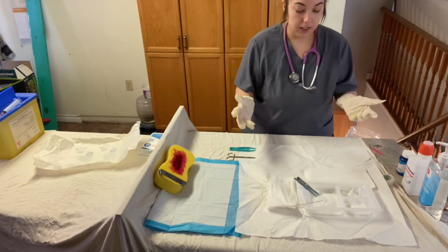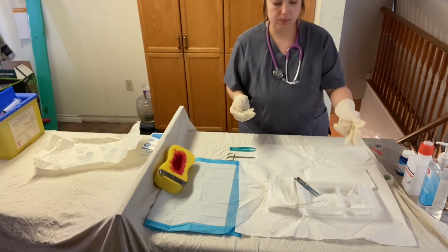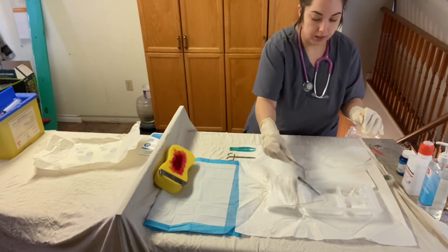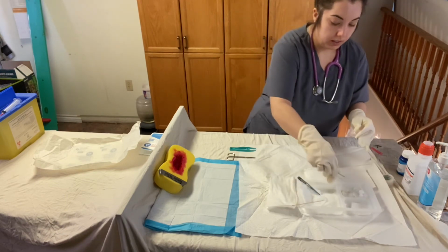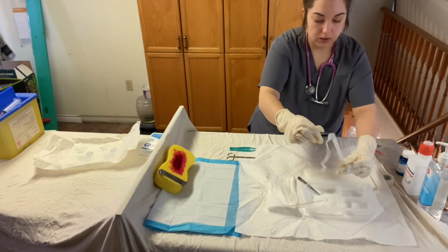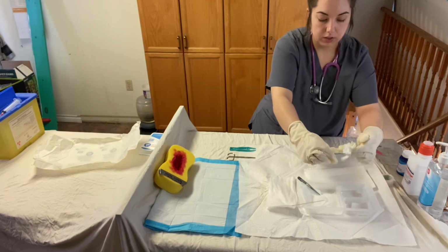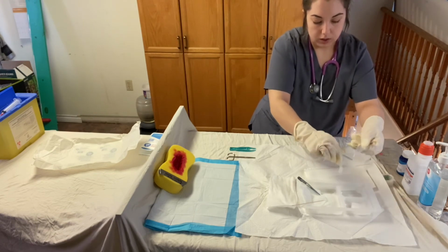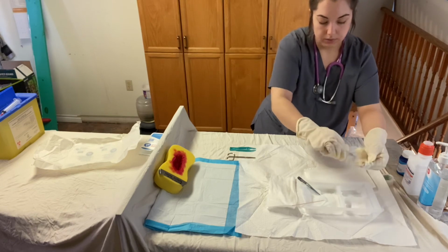Perfect. And then next what I'm going to do is I'm going to use my normal saline covered ribbon gauze. I'm going to use a pair of tweezers, and I'm going to just use my 2 fingers and slowly wrap it around and just drain it a little bit. I still want it to be somewhat damp, but I don't want it to be soaking wet. Perfect.